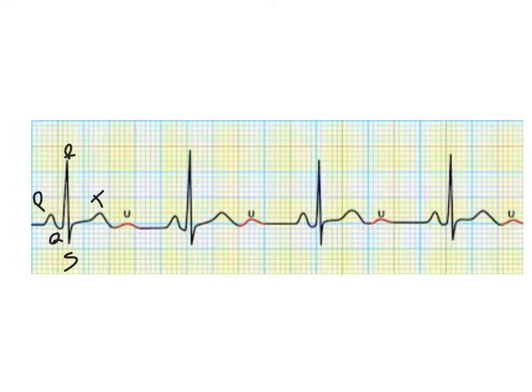As a matter of fact, this is a common question on certification tests. A very uncommon wave is the U wave, and when it's present, it usually means that you have some type of electrolyte deficiency, more specifically hypokalemia. The U wave will show up in cases of hypokalemia.